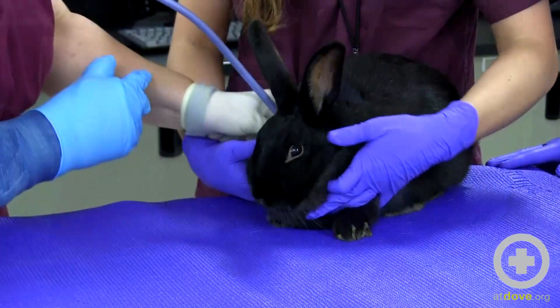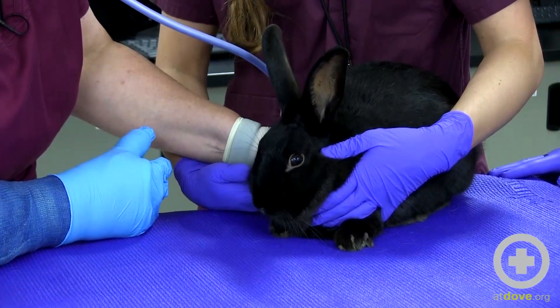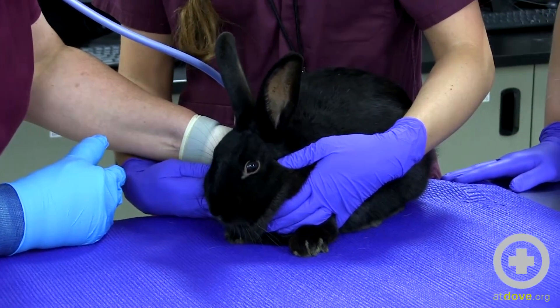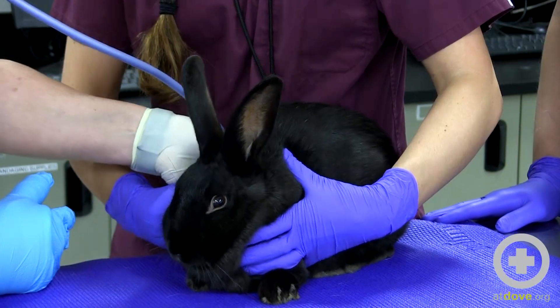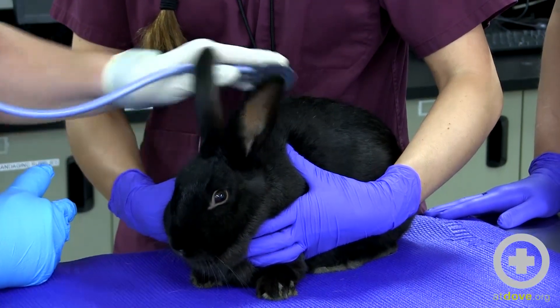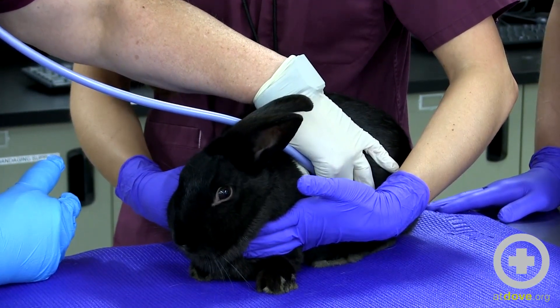When auscultating your rabbit with your stethoscope, it's the same general places as you would listen for a dog and cat. Listen on both sides, as you're always going to do with the physical exam. If you're listening for respiratory sounds, you can end up with a pneumonia in certain lung fields, so you have to make sure you get a good listen.